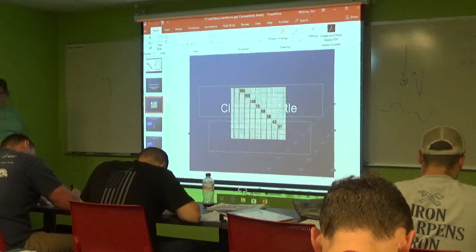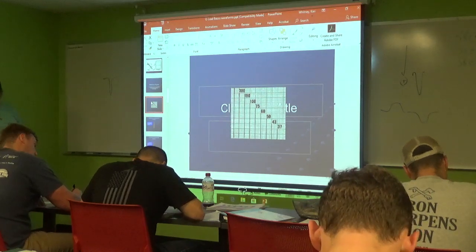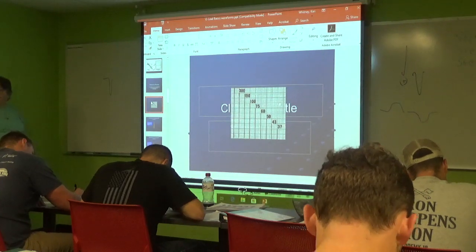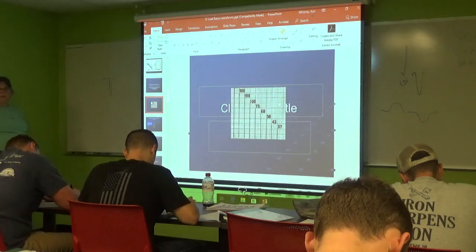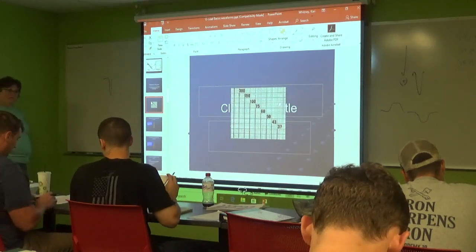Look at all three intervals. Your PRI, because it tells you if you've got a heart block for a lot of them. QRS, you have to really recognize regularly. That's going to give you your bundle branches. And QTC is going to give you the dangerous arrhythmia. So look at all three intervals to document normal intervals. If you don't have a normal one, put the interval there, and what does it mean? Prolonged QTC is important.